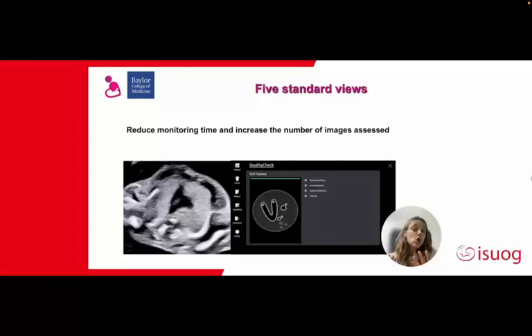So I hope you belong to one of those places where you routinely monitor images to assess the quality of your sonographers, of your team. If that is the case, you will for sure be reducing time, and at the same time, because there will be so many images that will be assessed, you will increase the number of images assessed, and therefore at the end of the day, operators will receive better feedback and the patients will receive overall a better assessment.